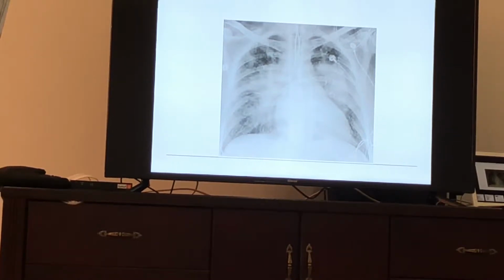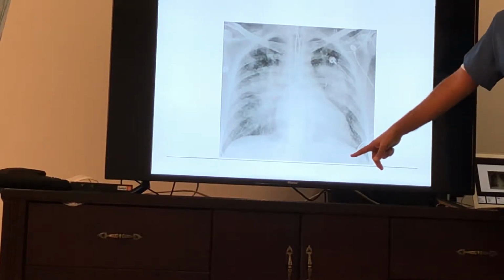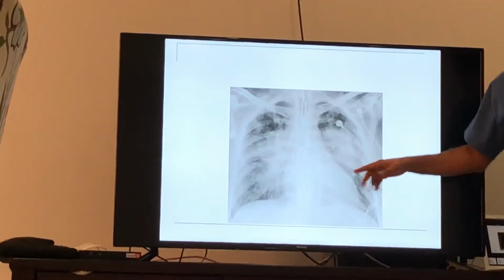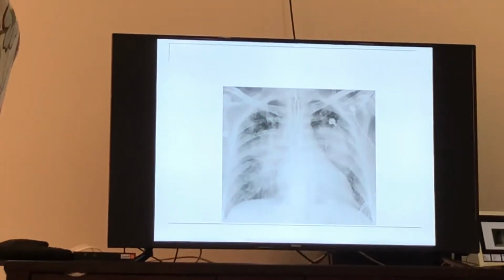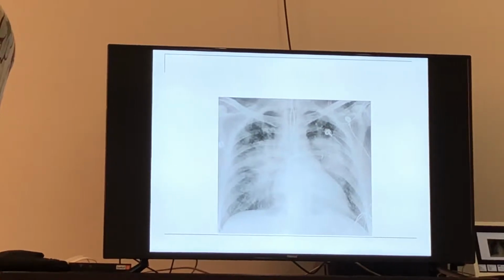What is the most common cause? We don't know if it's AP or PA. It's most likely AP, as we discussed today. Usually when you have loss of the fundic air bubble, the scapula is encroached, and you have electrodes, it's usually an AP. It's very difficult for a patient like this to stand up and do a PA.